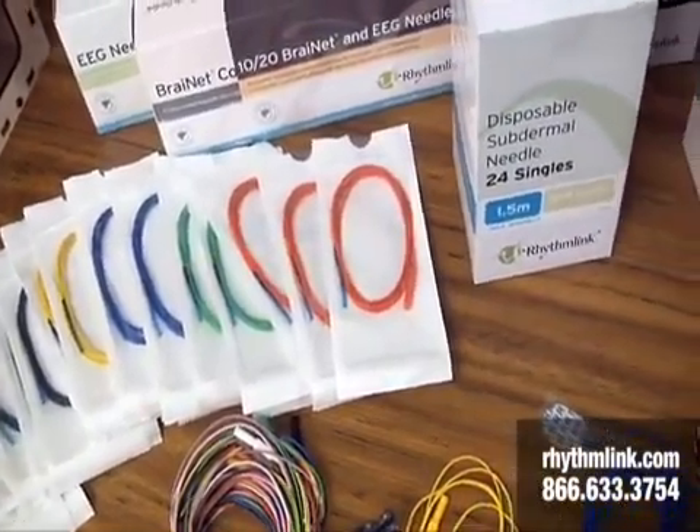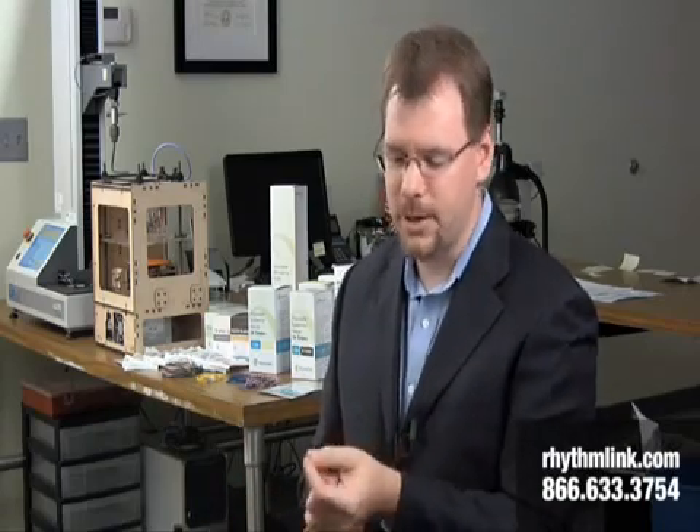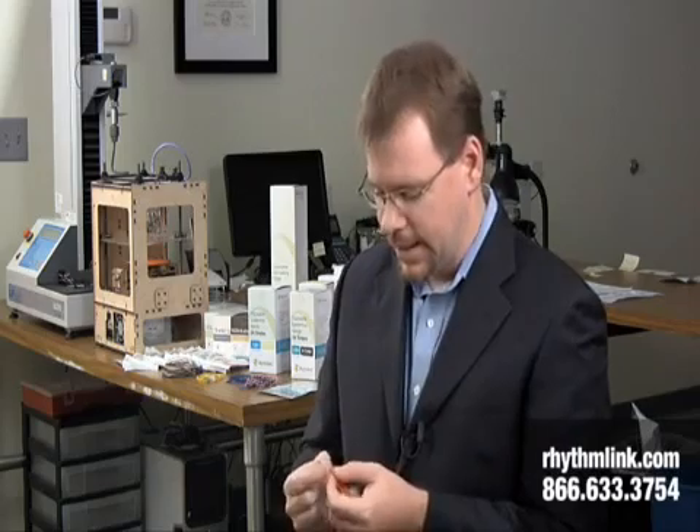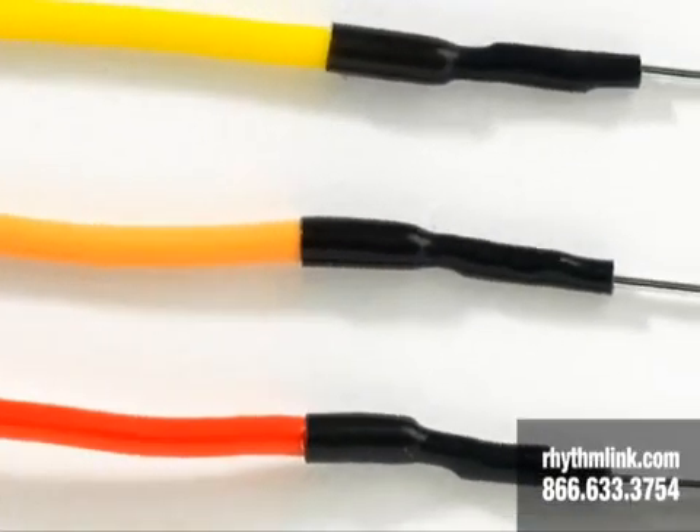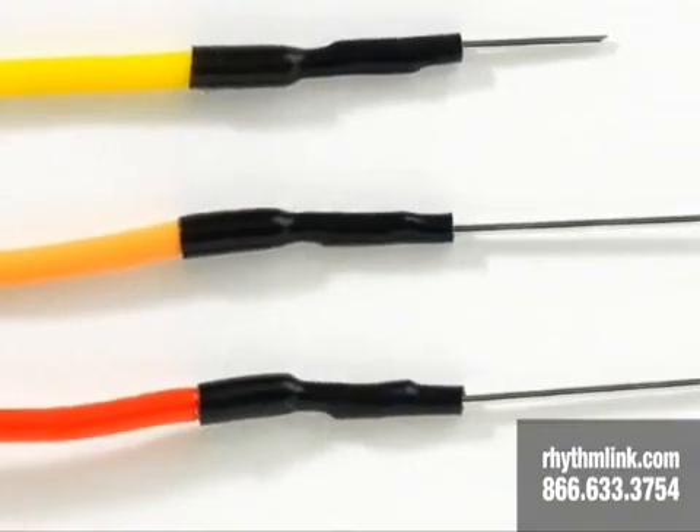We can also customize the lengths of these lead wires. The needles themselves are very small and very sharp. They're inserted into anesthetized patients, so no one feels them. They go right underneath the skin. It's a stainless steel needle. There's a black heat shrink that goes over a soldered joint, a soldered connection in there.